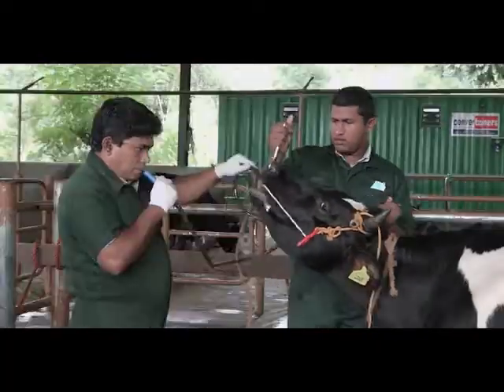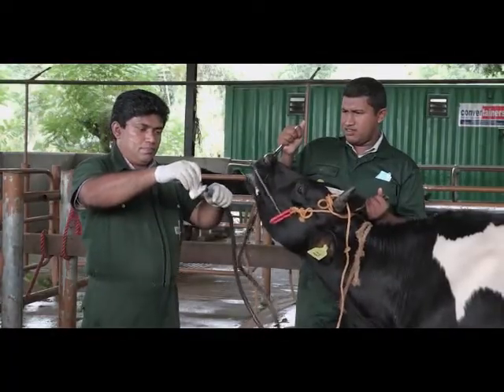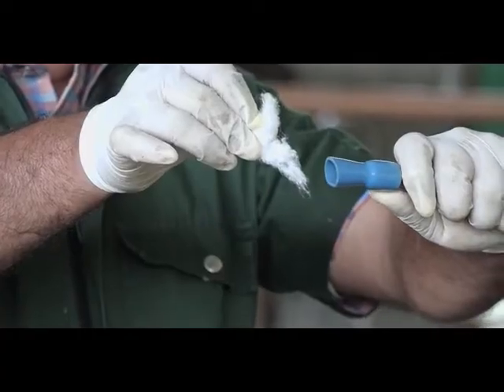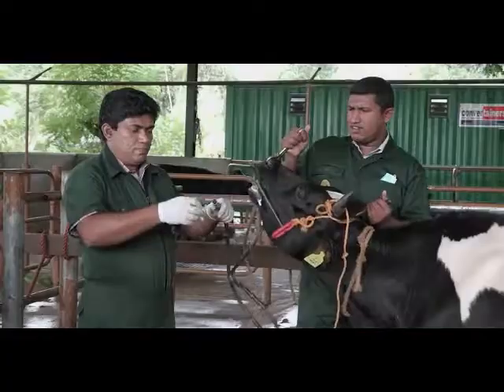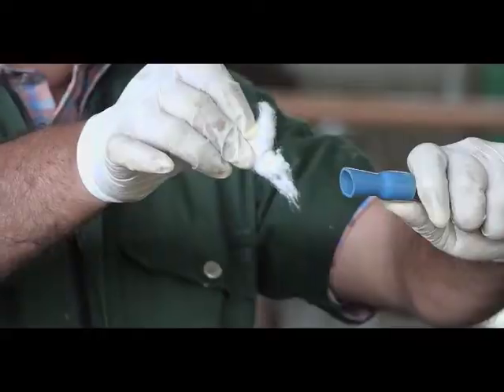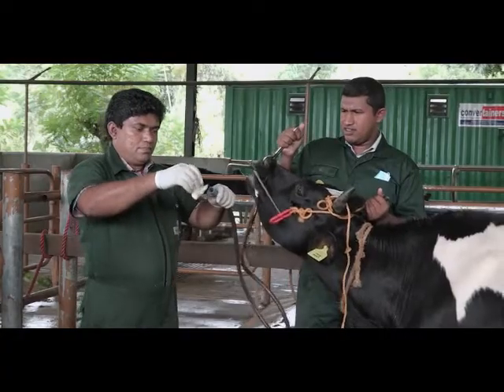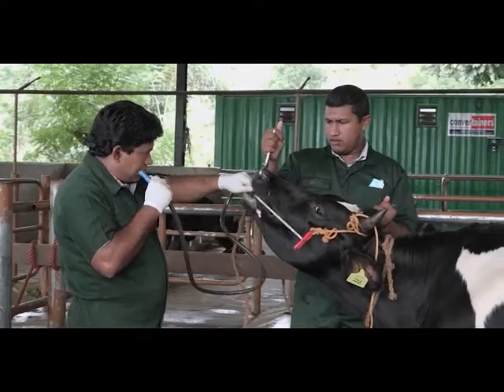After inserting the tube partially into the esophagus, hold some cotton wool in front of the outside opening of the tube to see whether any air is coming in and out of the tube. This is an important step to check whether the tube has accidentally gone into the trachea. If the tube has gone into the trachea, you will see movement of the cotton wool corresponding to breathing of the animal. If you don't see any movement of air in and out of the tube, you can further insert the tube towards the rumen.